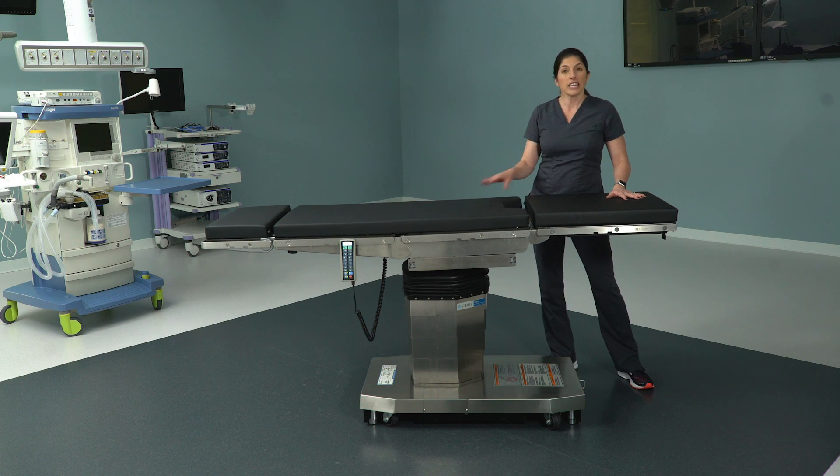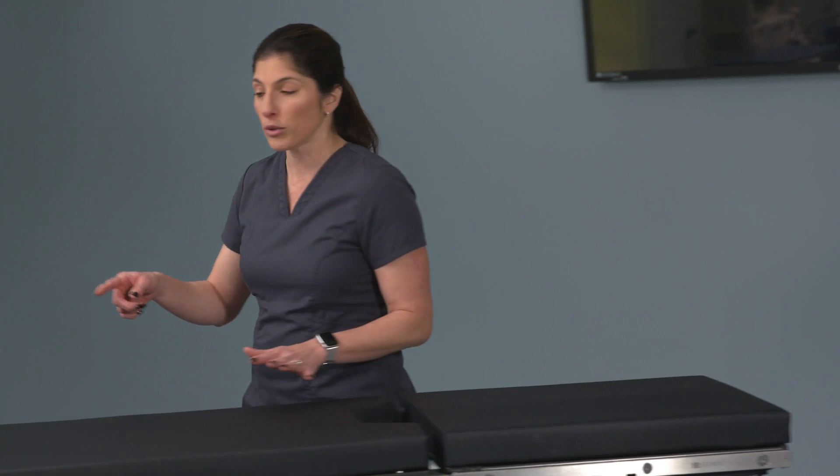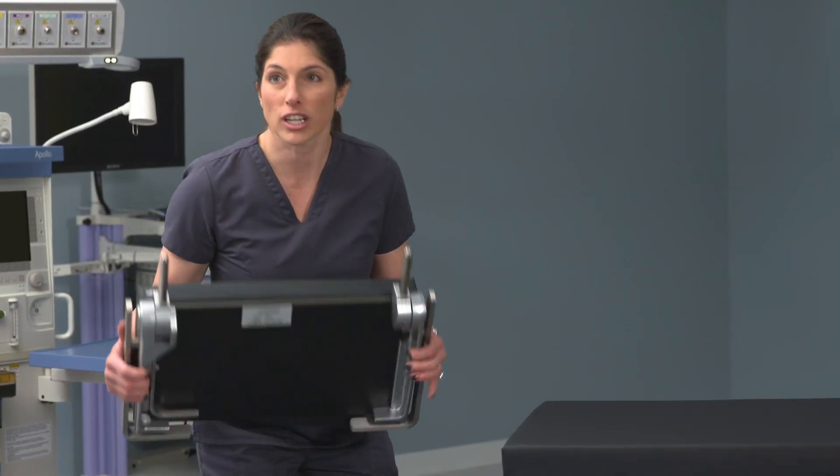Important to note that the head section on the 5085 is exactly the same as the head section on the 3085. It's also important to know that there are two ways you can set up the 5085 for cysto cases, GYN cases, or any case when you're putting the patient's legs up into lithotomy and stirrups. The first way is exactly like you're accustomed to on the 3085, using the head section of the table.